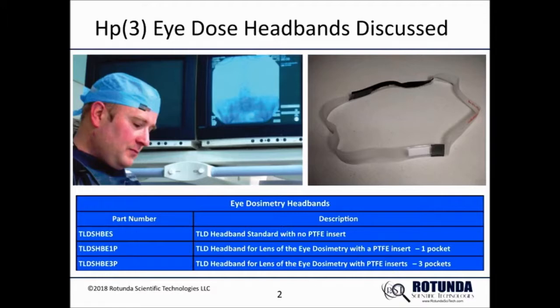The TLD headband for lens of the eye dosimetry with PTFE inserts having three pockets allows the wearer to position a dosimeter element over each eye and one in the center, to measure dose to each eye as well as the dose to the center of the forehead.